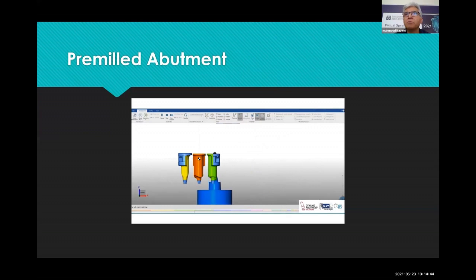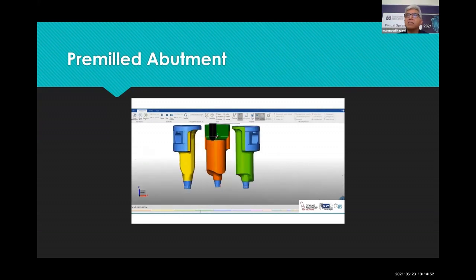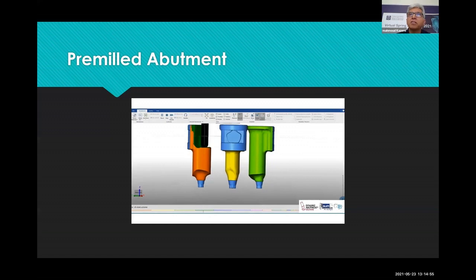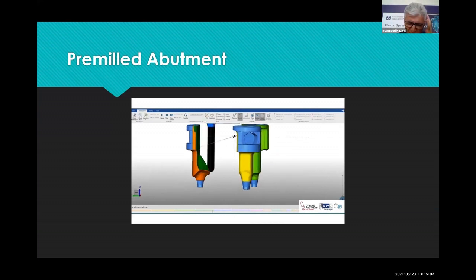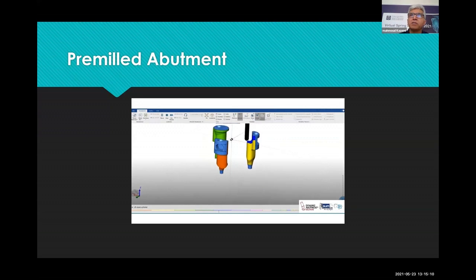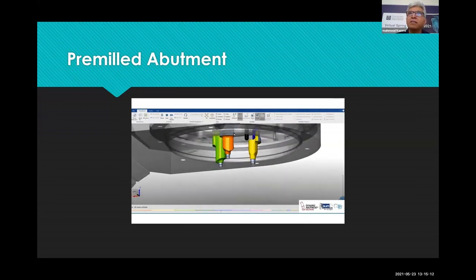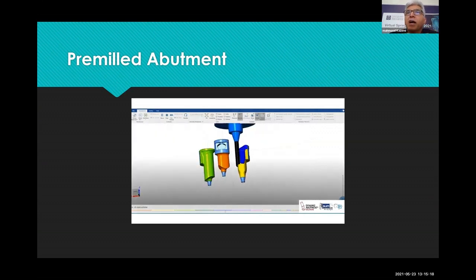And the other common mistake about the customized abutment, when we use UCLA abutment or milling abutment, is that they think when 2 or 3 implants should be splinted with screw type prostheses, we can use non-engaging UCLA or milling abutment. Non-engaging UCLA abutments just let you rotate the implant without any engagement.